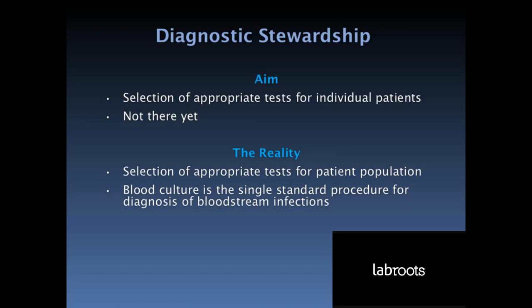I strongly believe that the detection of bloodstream infection is one of the most important functions of the clinical laboratory. Therefore, a laboratory needs to use the best available blood culture system. You may be able to cut costs on other tests like urine cultures, but always make sure you have the best quality blood culture system you can get.